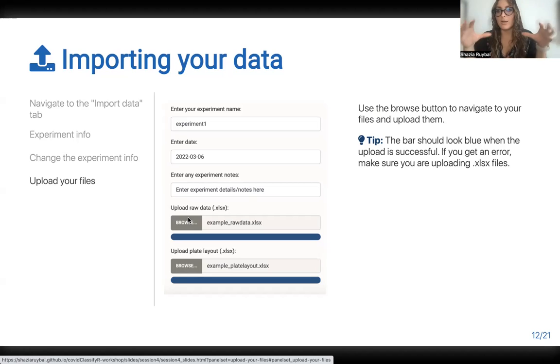So for the ABC study, I have a folder, then I have plate 1, plate 2, plate 3, and all of the files, the raw files and the processed files. That's how I would envision this can help you do that. Obviously everybody has different systems, but that would be a suggestion from my end.